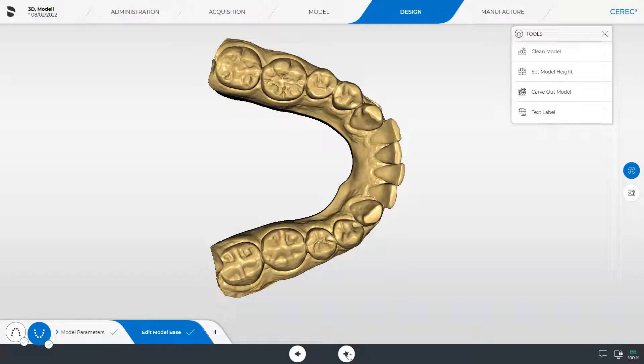When entering the design phase, an initial proposal for the model to be printed is displayed. There are several tools available to edit this proposal as needed.